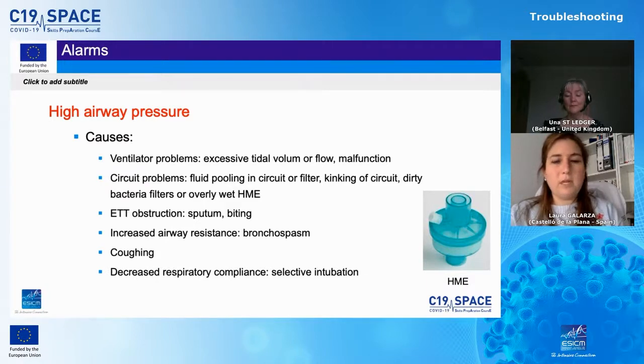Another cause for this alarm is a decrease in respiratory compliance. It can be seen when there's a selective intubation or a pneumothorax, but also when our patient is worsening in the respiratory tract.